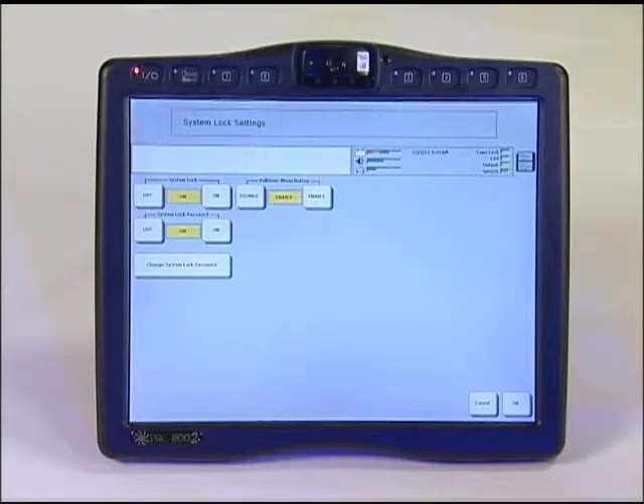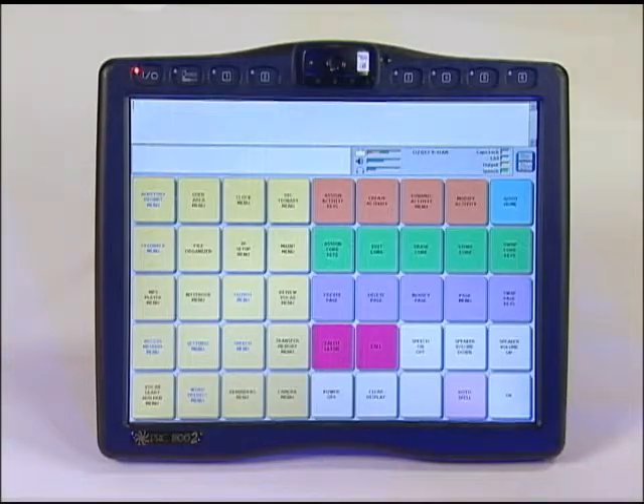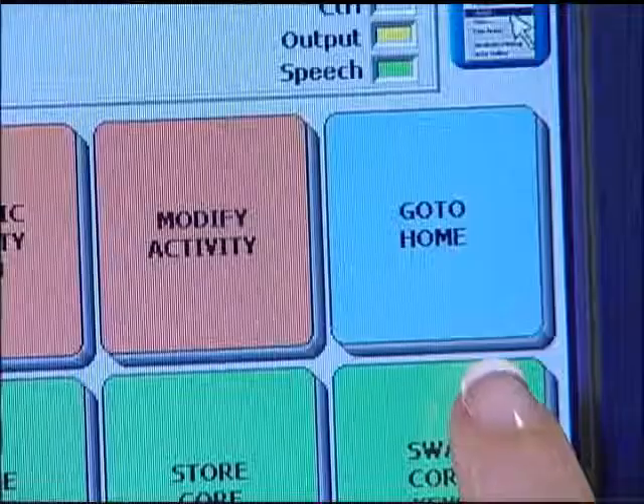Set the system lock to ON by touching the ON key. The system lock is ON and password protected. Select OK and then OK again. Exit the toolbox using the light blue go to home key at the top right of the screen.